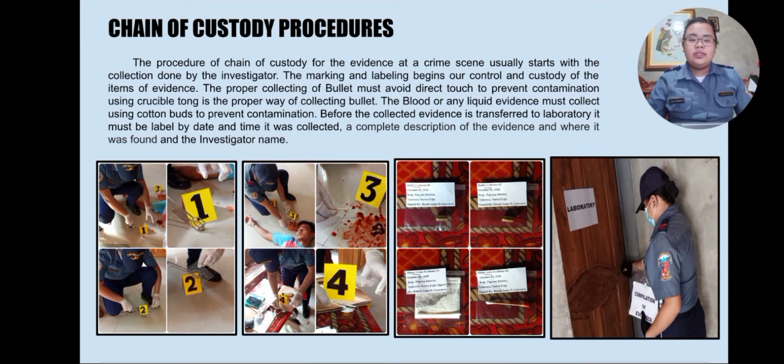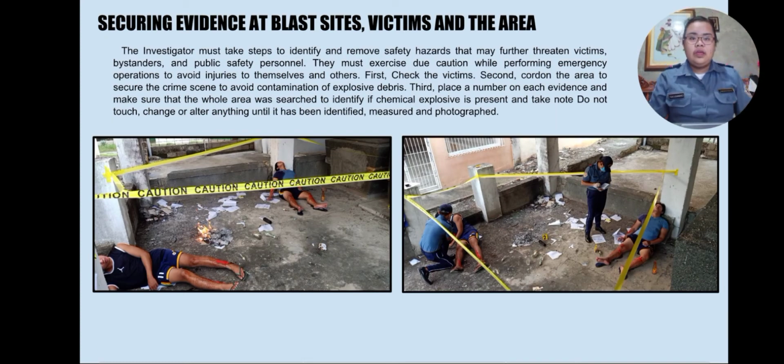So, before the collected evidence is transferred to the laboratory, it must be labeled with the date and time it was collected, a complete description of the evidence, where it was found, and the investigator's name and signature. So, dito daw po sa chain of custody procedure, kailangan daw po buo yung information or tama para maiwasan po yung confusion. So, let's proceed to securing evidence at the blast sites, victims, and the area.